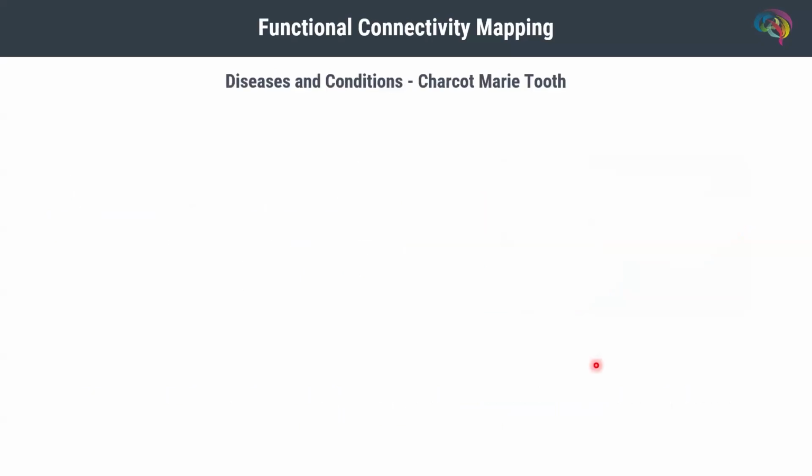But then we also said how functional connectivity has been shown to be disrupted across several neurological disorders, and in these publications the authors set out to study a mouse model of the Charcot-Marie-Tooth disease, as you see on the title, that in humans is a peripheral neuropathy causing decreased nerve conduction, paralysis, and tremor.